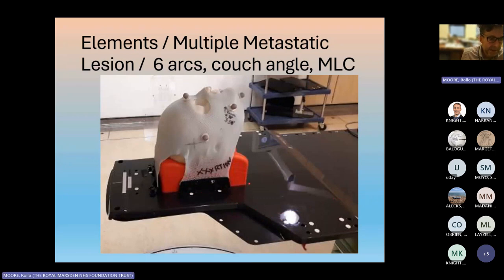that's all right. So this is showing one aspect of the patient preparation, a fixation mask that's usually made in the mold room or CT when the patient first arrives. And this is for our Phantom, the one in the previous picture, that is in fact a 3D printed plastic shell with anatomy in, and it's water filled. We call it RT ion for a reason I'll tell you later, but it's in a particular mask with some fixation and position detecting bobbles on the top.